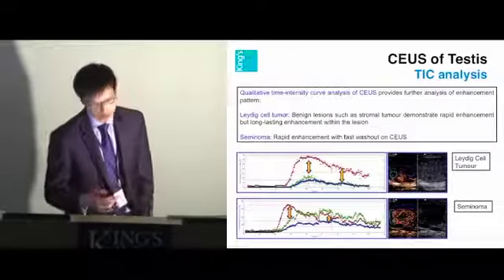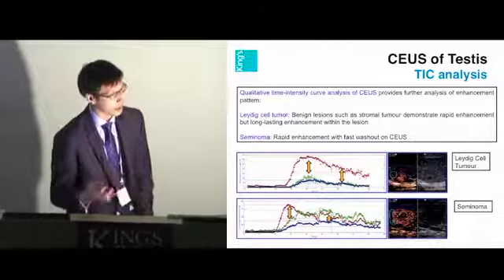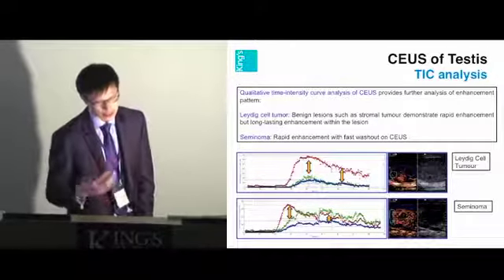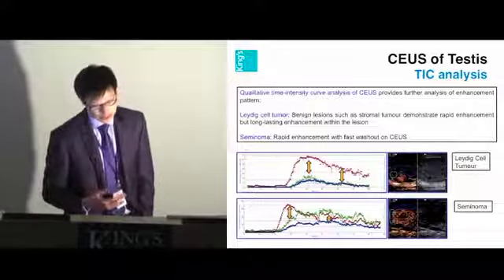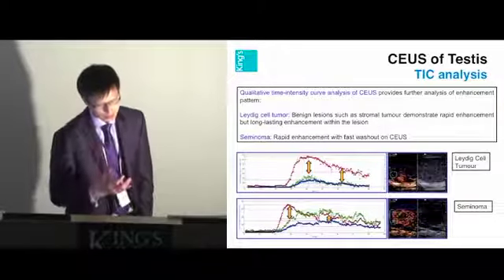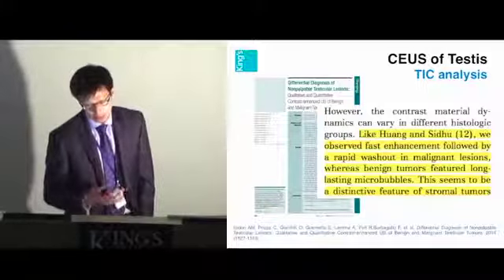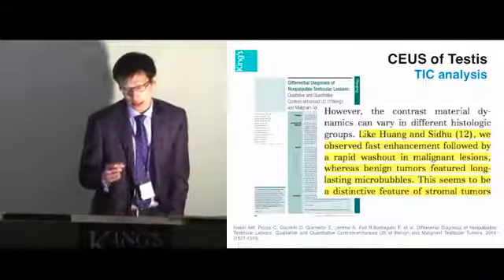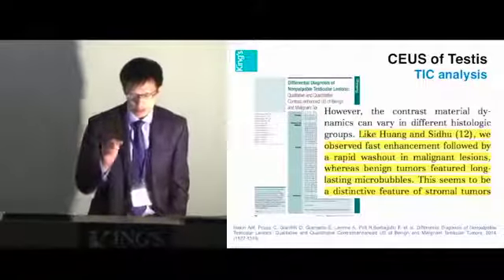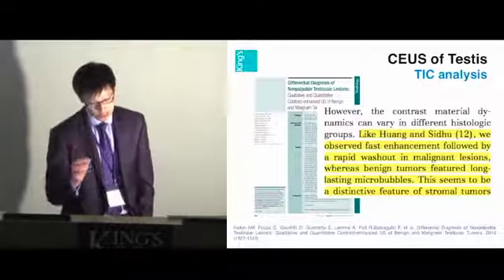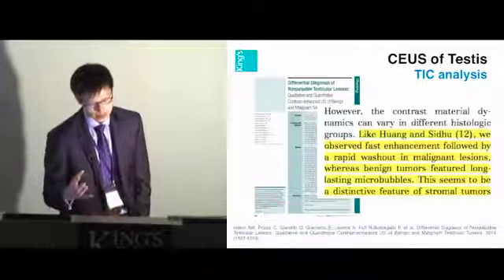These differences can be demonstrated on time-intensity curves, showing a larger differentiation between these tumors and the surrounding parenchyma. Studies have looked at peak values, time-to-peak values, and washout patterns to demonstrate differentiation between the two tumor types. When a lesion enhances rapidly with rapid washout, it is more likely malignant, whereas a benign vascular lesion features a long washout of microbubbles. These are useful features to further characterize a vascular testicular lesion.